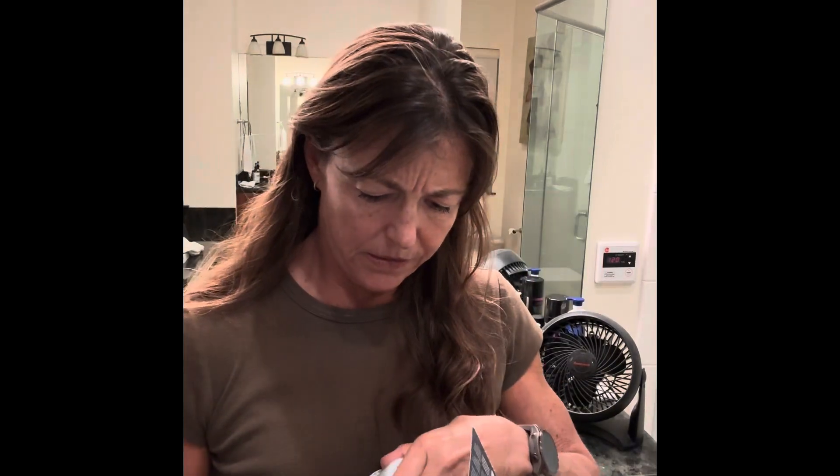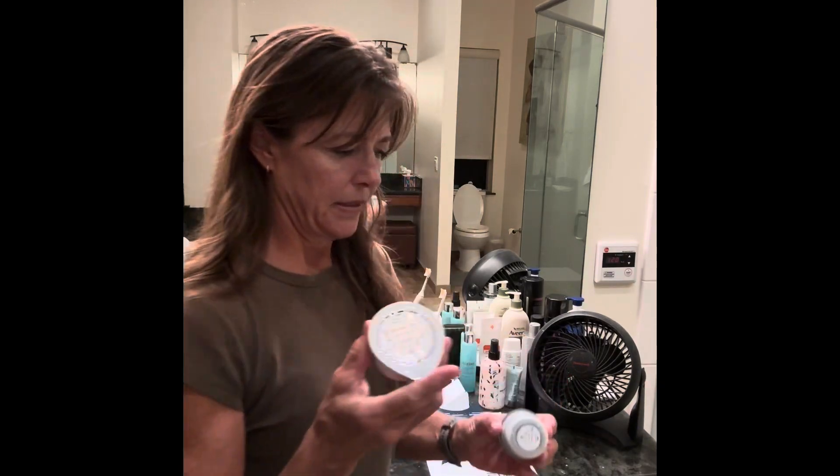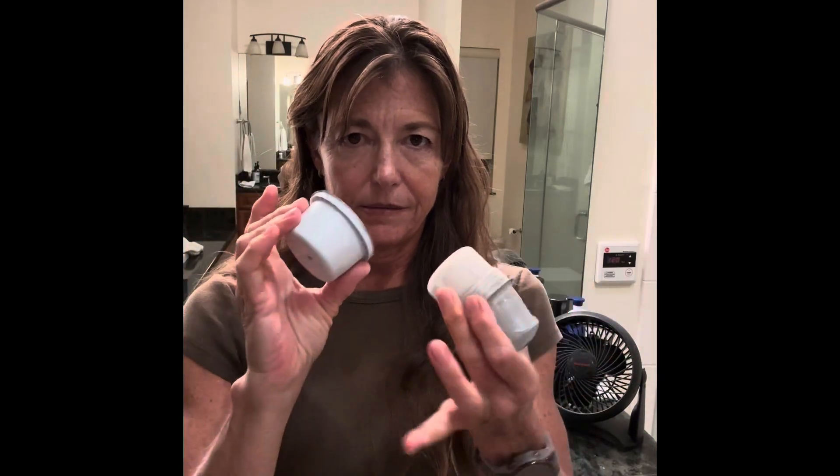We have one little pod and the box is... let's see what we got — this and this. So I need to read the instructions and find out what to do next.